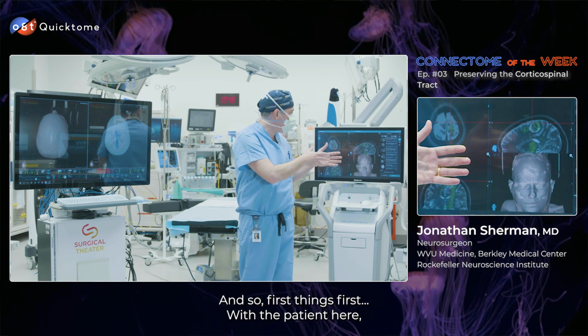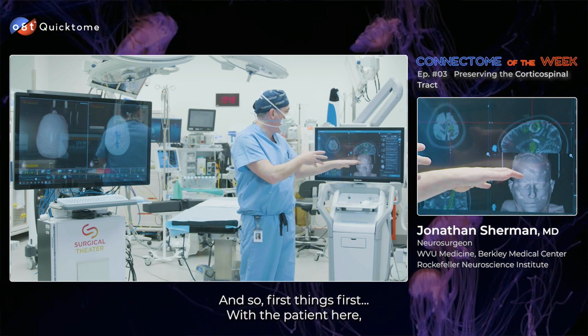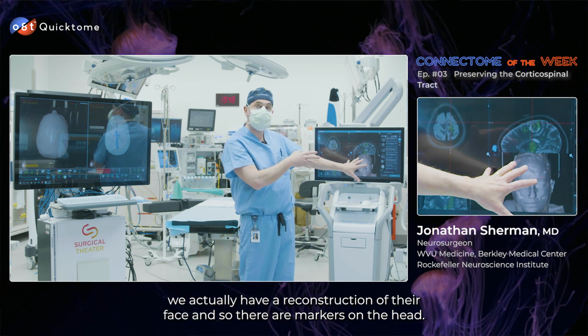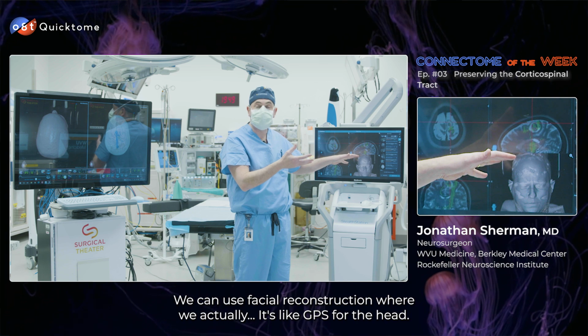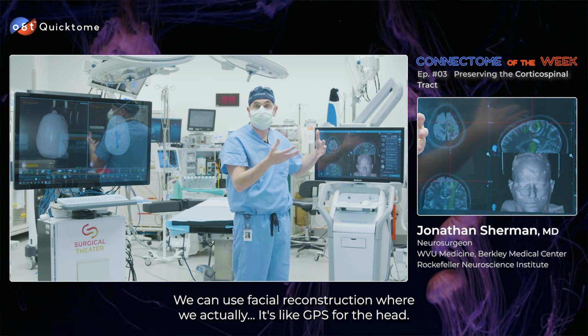And so first things first, with the patient here, we actually have a reconstruction of their face. And so there are markers on the head. We can use facial reconstruction, where it's like GPS for the head.